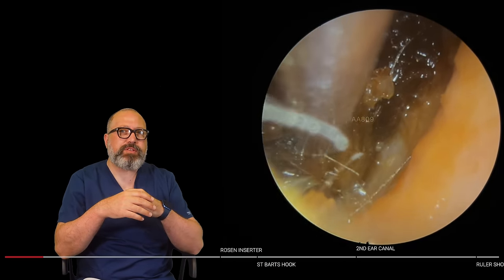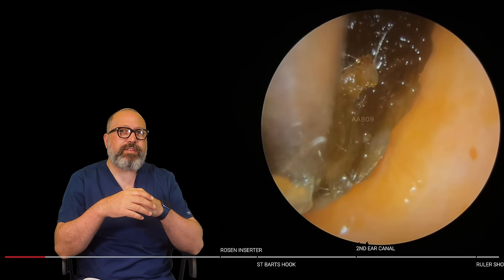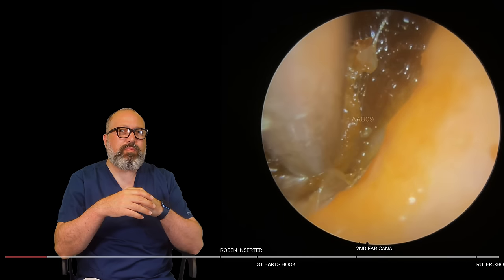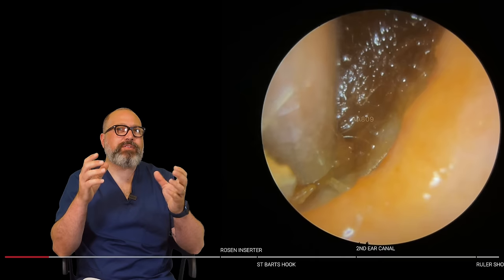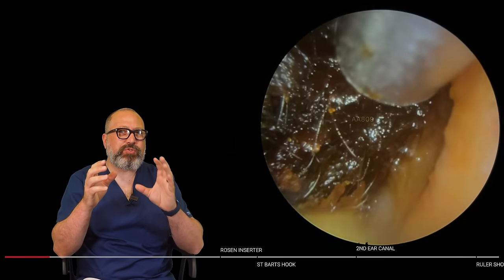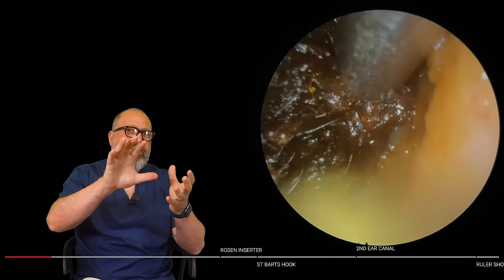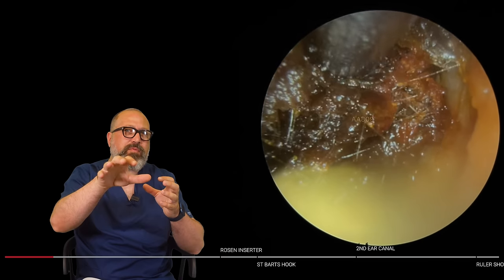So just working around the one side of the plug now, lifting from the base of the canal wall. You can see I'm really trying to get this whole plug moving if I can. Obviously at this point, I don't realize that it's lots of little bits all gelled together. So I'm looking at this larger, darker section you can see there. There's a little bit of wax on the bottom of the camera there. We'll move that in a second.